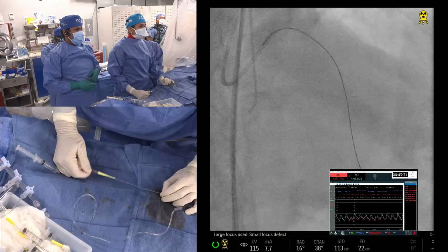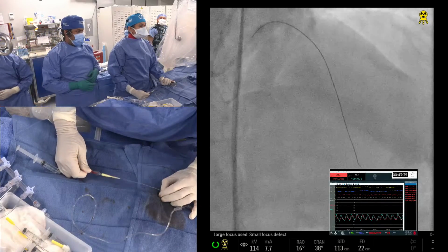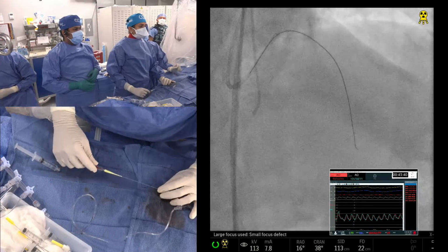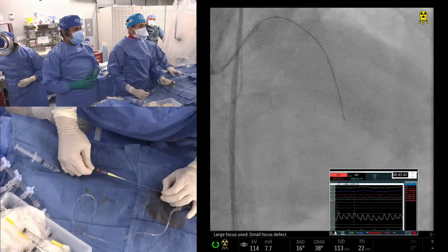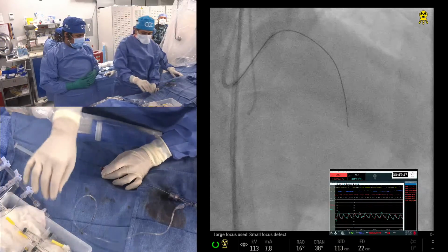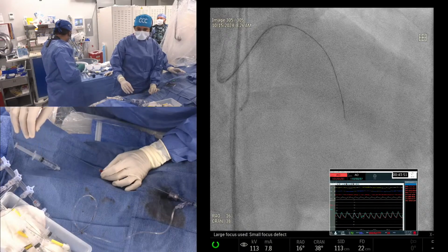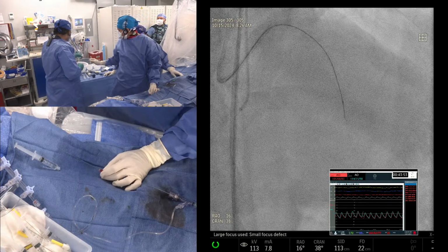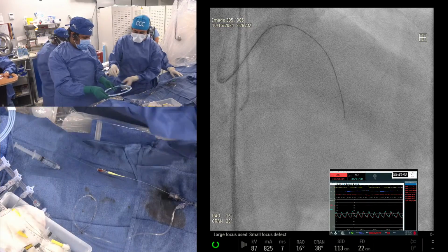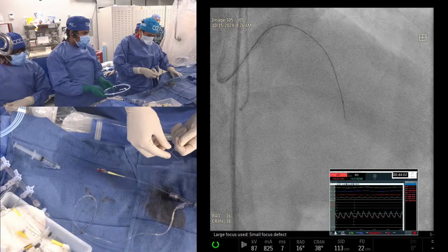So you see how you will advance. Are you showing my finger movements? Yes, they're showing the hand movement, rotate and advance. And no PVC. That is a good sign that you are in the true lumen and not going epicardial. Okay, 300, run through. And get a 2.0 by 20 compliant balloon. 2.0 by 20 first, and then we can get 2.5 by 30.